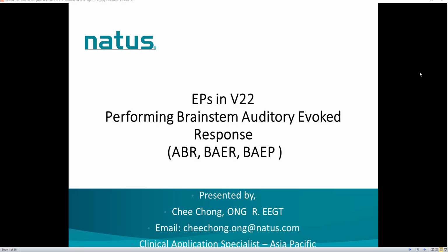Today I'll be presenting brainstem auditory evoked response, also known as ABR, BAER or BAEP.